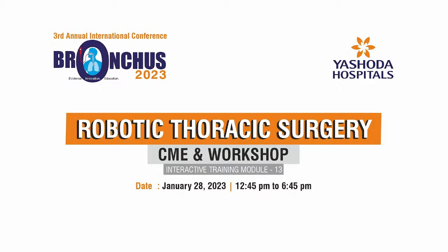So when you go by the perimammary approach, wouldn't the heart be in your way? Suppose you have a hypertensive patient who has some LV hypertrophy, some cardiomegaly. Will the heart be in your way? Yeah, because we only open the incision posteriorly, and often the incision is at the very point where the uniportal guys or uniportal robotic surgeons place it. So we have a little bit more anterior approach, wider in the incision, but far away from the heart.